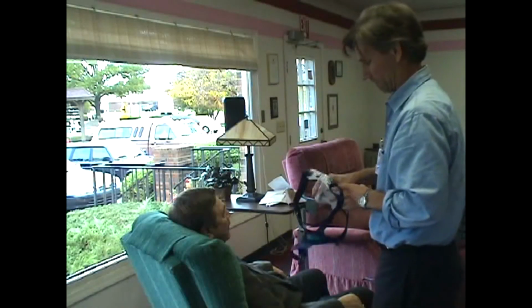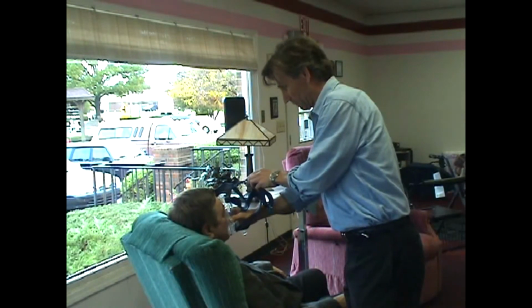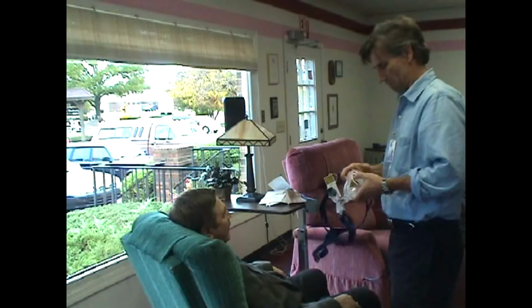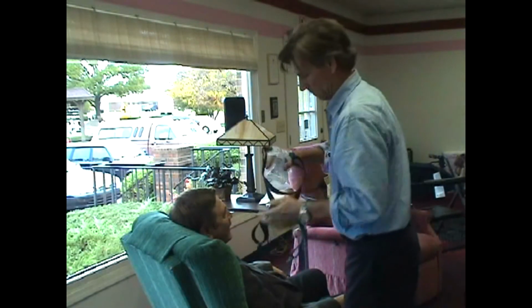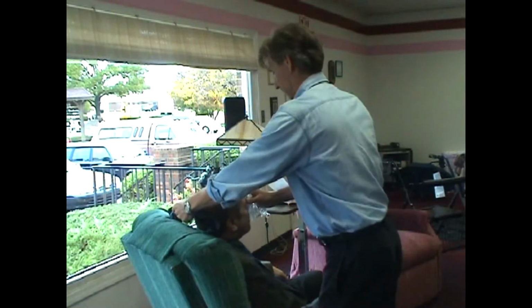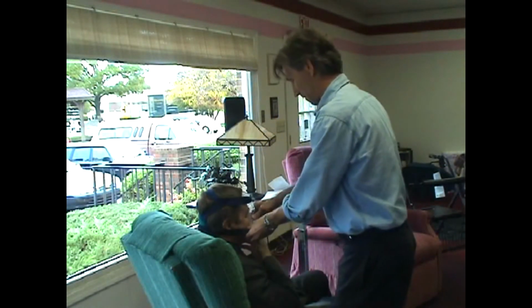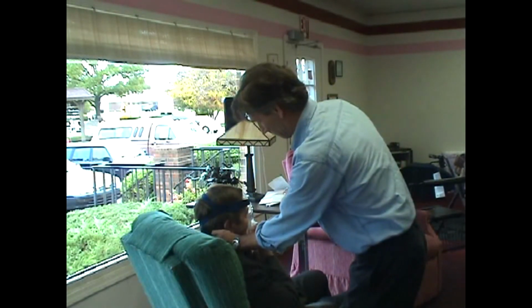I really enjoy setting CPAPs up. It's very difficult for a lot of people to tolerate the CPAP, so that's where the coaching comes in and proper mask fitting technique. If a patient doesn't have a mask that fits comfortably and doesn't leak, then it's just not going to work. So I'm not only a technician in that sense, but I'm also a coach. So it's been quite rewarding for me.